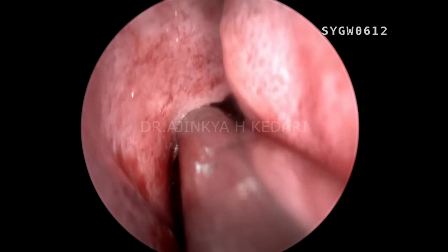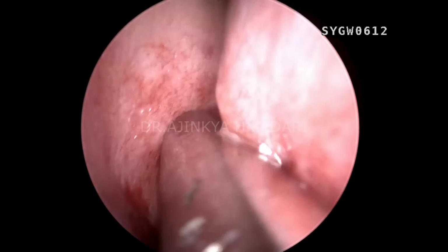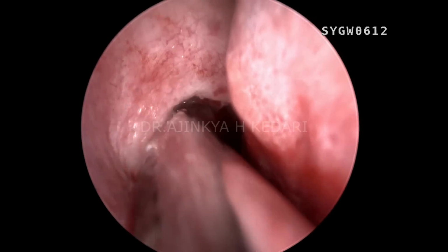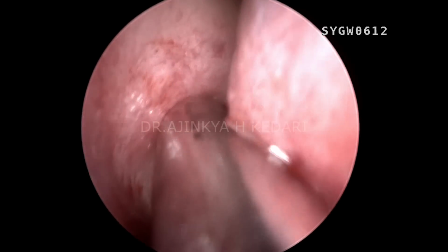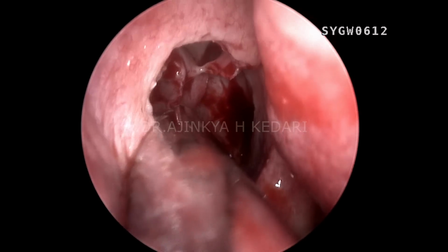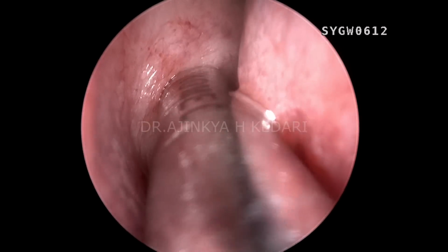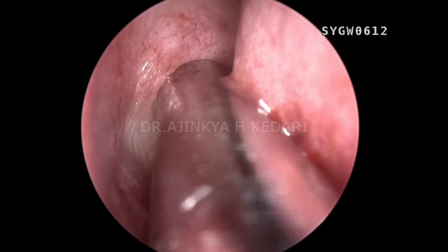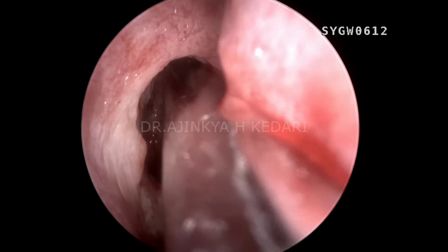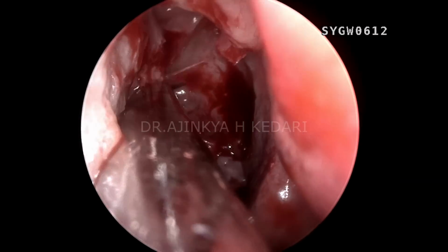So you need to flush the entire area, remove the uncinate, vertical and horizontal processes, then completely open up the maxillary sinus, and expose the floor of the orbit through the maxillary sinus. That will act as a landmark. You can see I'm trying to debride the uppermost part of the vertical uncinate near the agger as well. So you can debride the entire axillary mucosa, soft tissue, and expose the frontal process of the maxilla as much as you can. That's going to give me a more superior vision the way I'm doing right now.